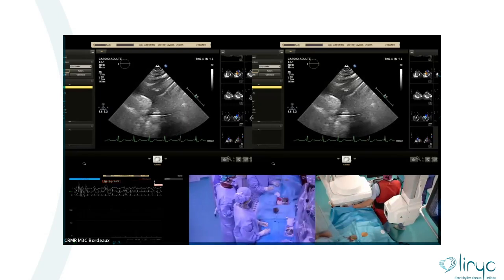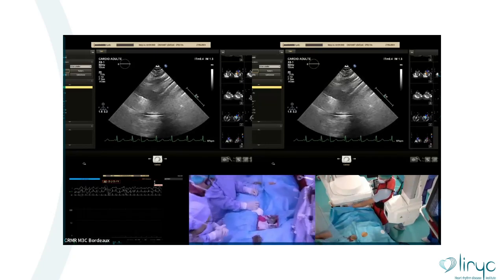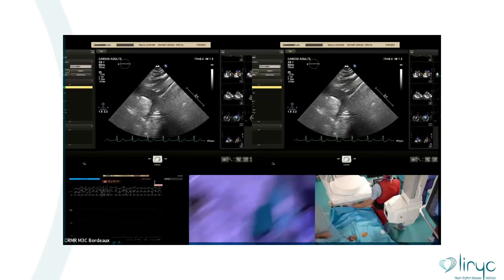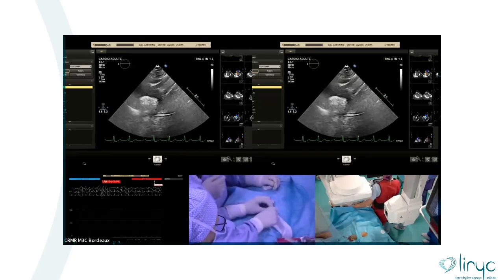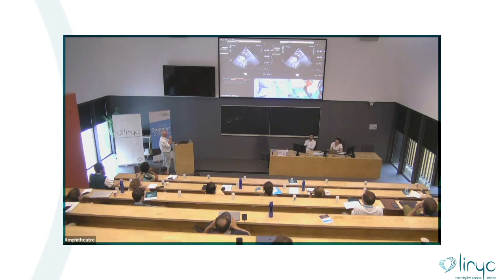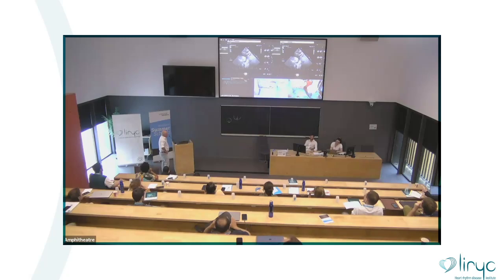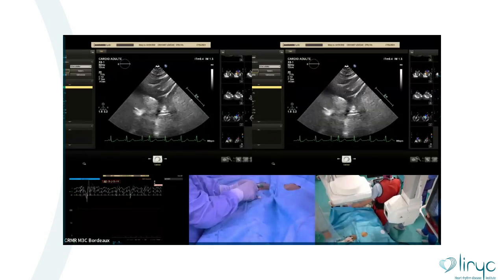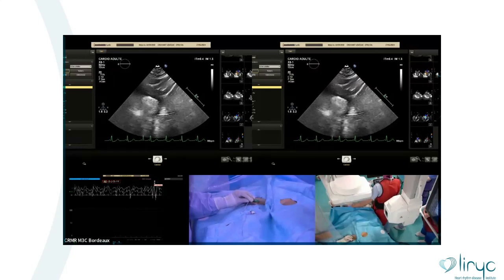I'm not sure that you can see the cut pigtail. Okay, let's go. Mark, do you have any comments about the sizing? Dr. Pan and Zach said we take a 10-8 device. So that means the center of the device is 10 millimeters, and the disc is going to be 14 millimeters, right? Exactly. Which is rather big.